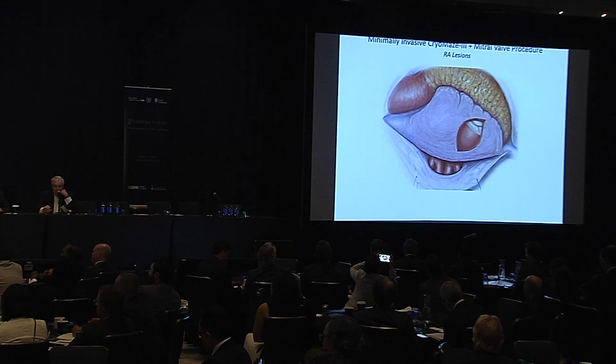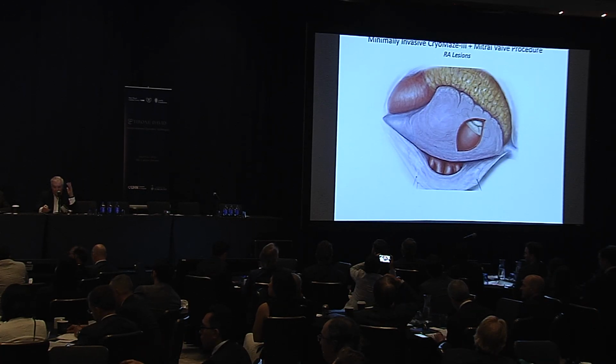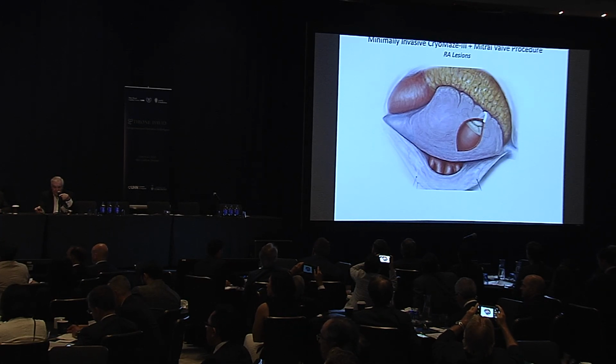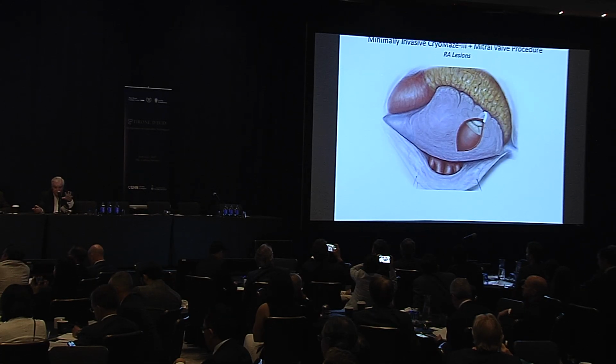So I always put the proximal end of this atriotomy on the right side about 2/3 of the way down between the SVC and IVC. Take it diagonally over to the edge of the AV groove and stop, because you can't put it all the way down to the tricuspid valve yet. What you then do is put a curved cryoprobe in at the distal end of the atriotomy, curve it, take it down across the tricuspid valve, 2 minutes, stop. That's what we call the T lesion.